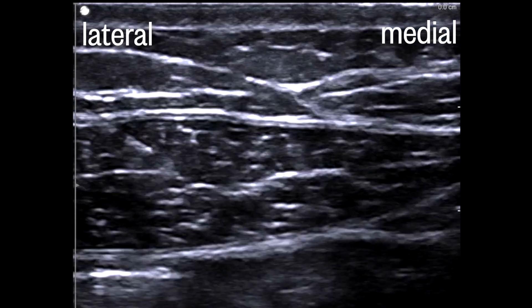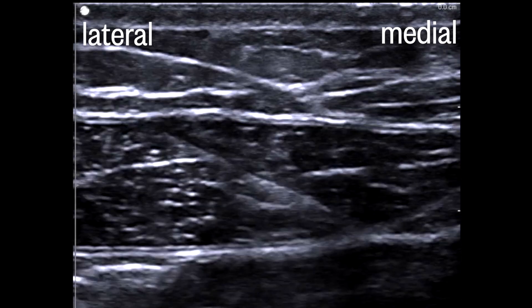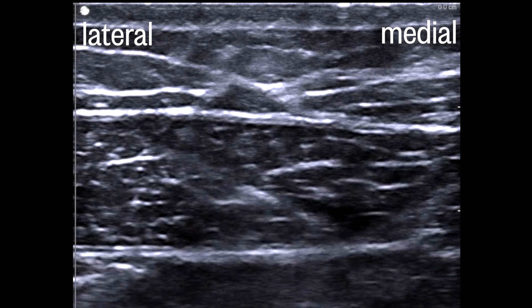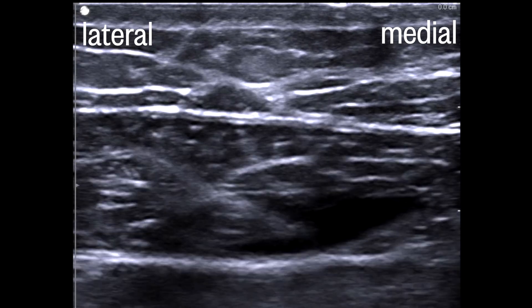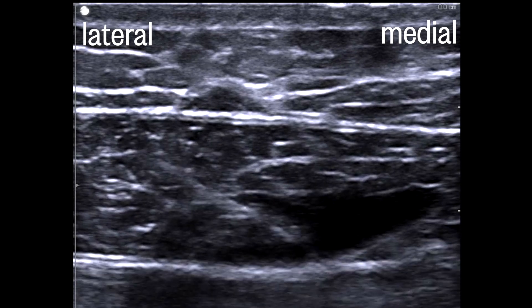Here's what this looks like: the needle enters from the lateral aspect, traveling through the rectus muscle. The aim is to pass just through the rectus muscle without passing through the sheath itself. You may feel a small give and then some resistance as the blunt needle meets the tough fascia. After negative aspiration, a test injection is performed, which confirms that the tip is not intramuscular and is indeed in the potential space beneath the muscle.